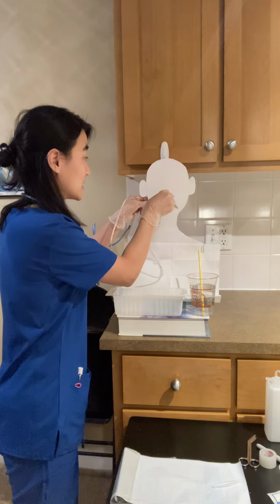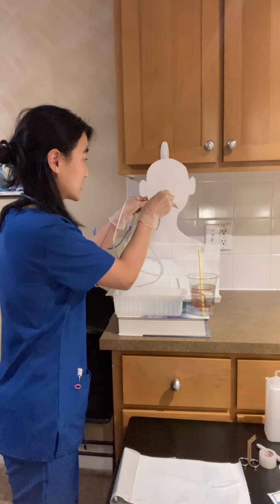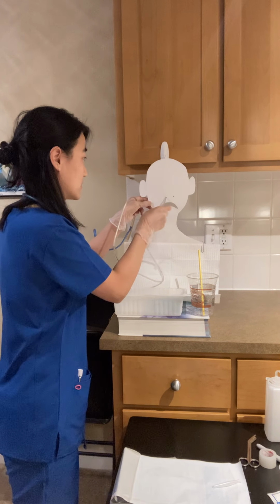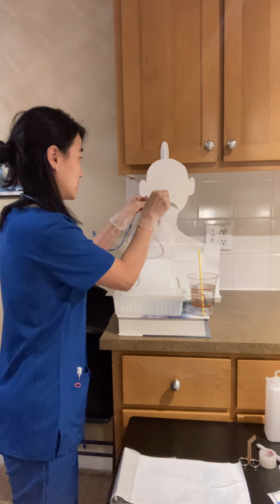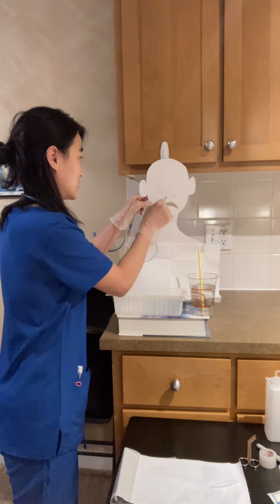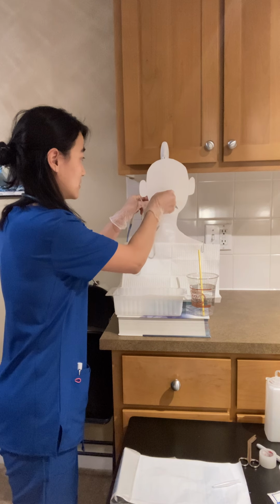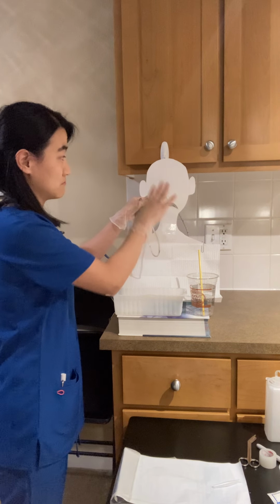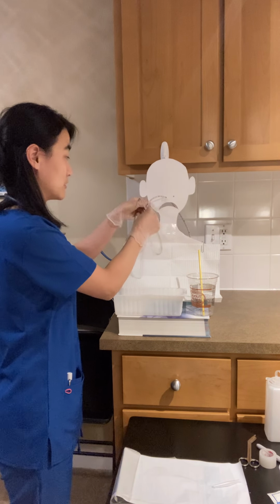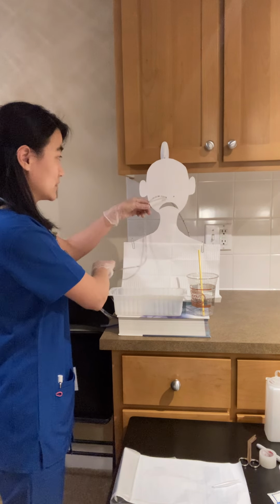Alright, and then go ahead and tuck your chin and start taking sips of water. So gulp, gulp, swallow, swallow, swallow, swallow.